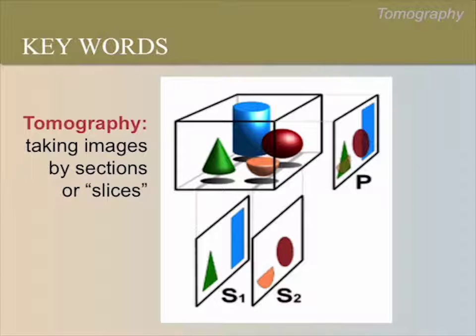Tomography simply means taking images or pictures in slices. This is how ultrasound works. Imagine if we sliced a knife through this box towards the front and then towards the back. Those slices would look like S1 and S2 here. Ultrasound takes images in the same way.